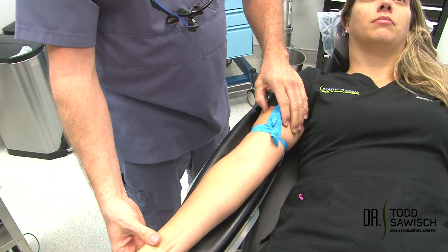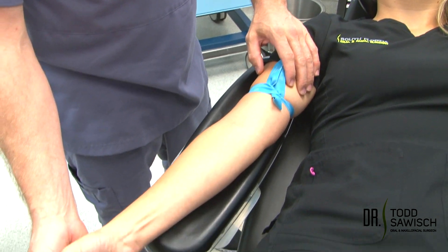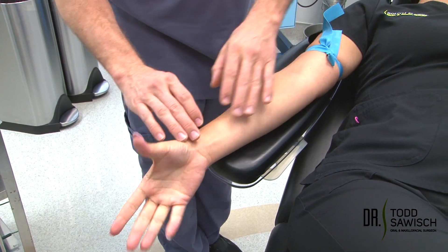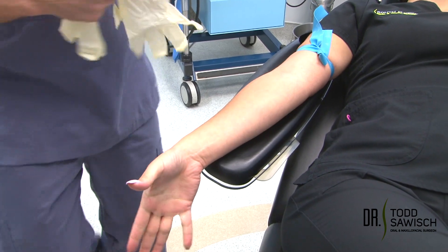We're going to have the patient open and close their hand — open all the way, close all the way — and the patient is going to continue to do that. It's going to cause venous congestion and the veins are going to stand out more. I'm going to put some gloves on.